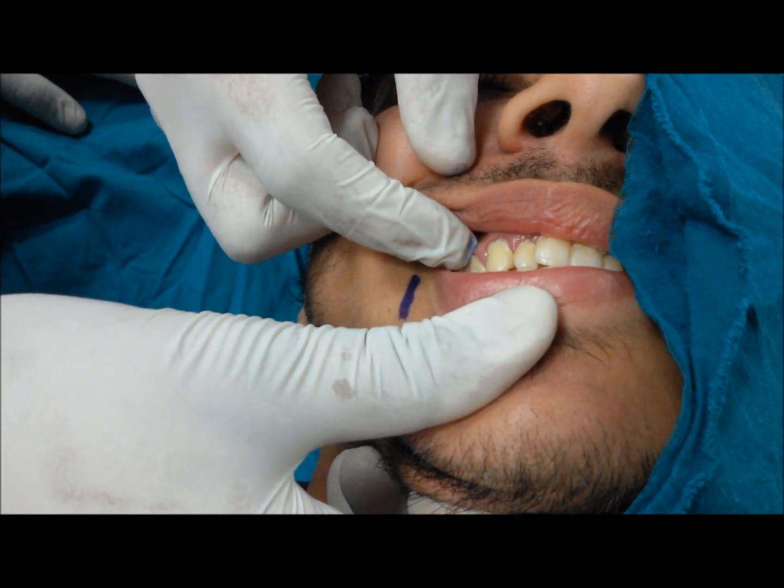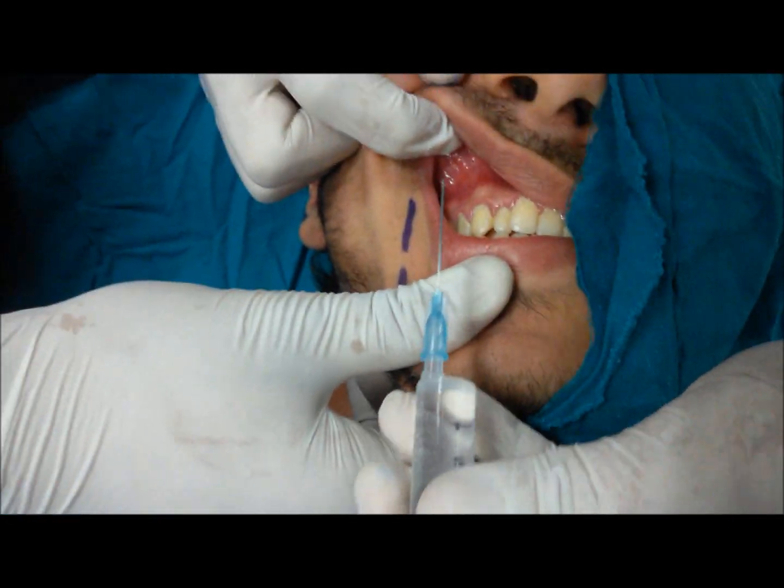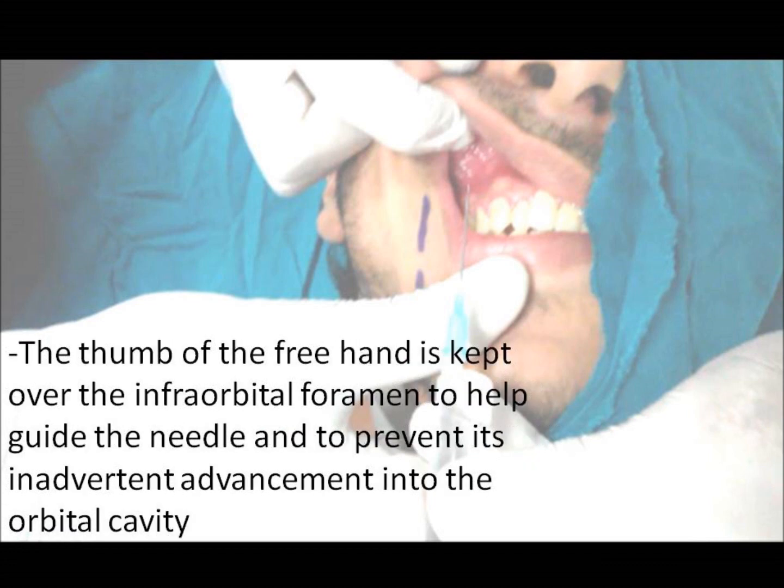The upper lip is retracted upwards and laterally to expose the buccal gingival fold opposite the first maxillary premolar. The needle is inserted in the apex of the buccal gingival fold, parallel to the long axis of the first maxillary premolar and directed towards the infraorbital foramen. The thumb of the free hand is kept over the infraorbital foramen to help guide the needle and to prevent its inadvertent advancement into the orbital cavity.